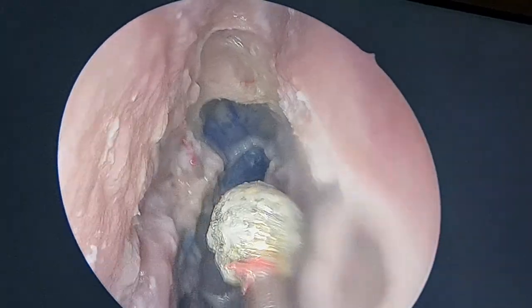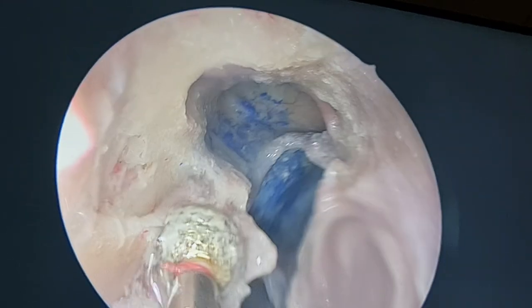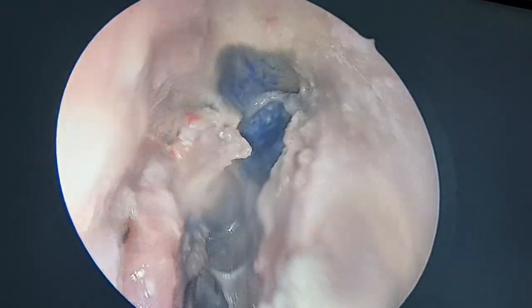So another approach described by Richard Harvey, my dear friend from Australia. He described an outside in approach. What he said is, you have seen the first olfactory fiber over here. Stay anteriorly directly there and drill open the frontal sinus first, and then come laterally outside. We are going from inside out, seeing the lateral wall first and coming all the way medially. He sees the olfactory fiber, goes anterior to it, first opens medially and then goes outside. It's safe. It's up to you.